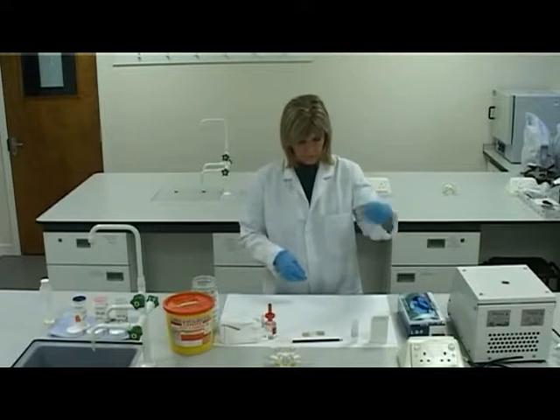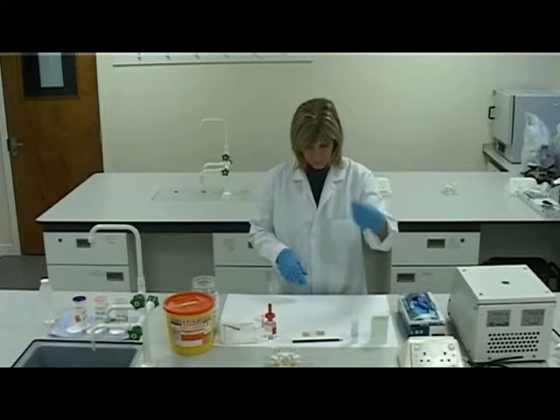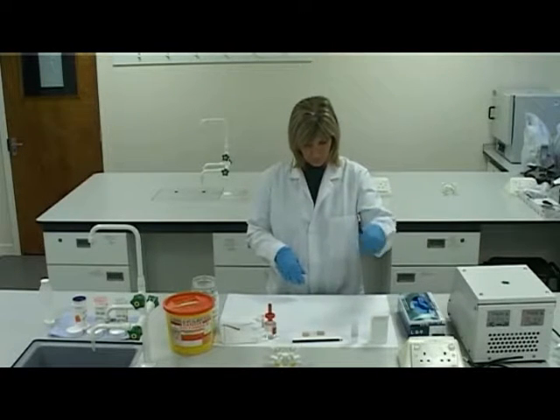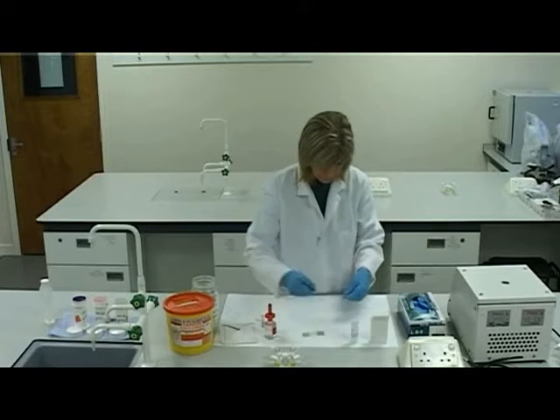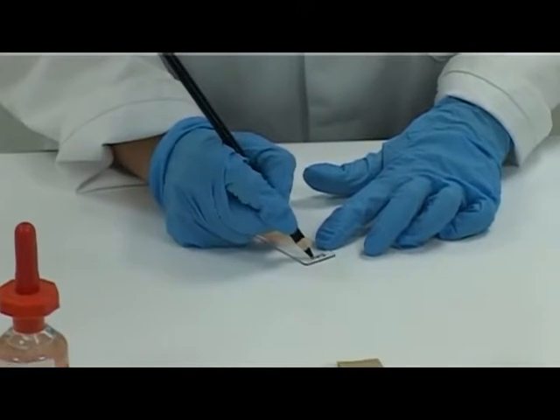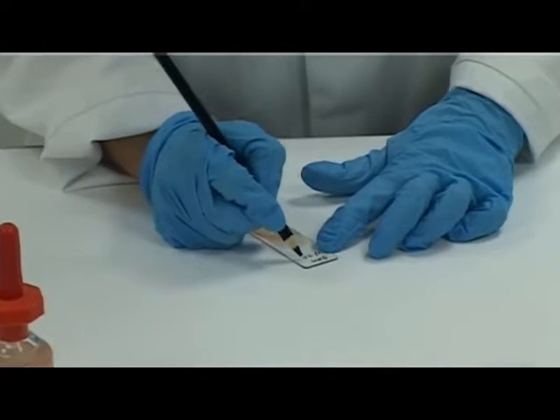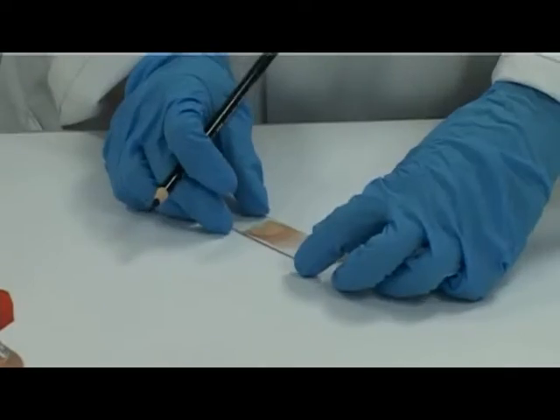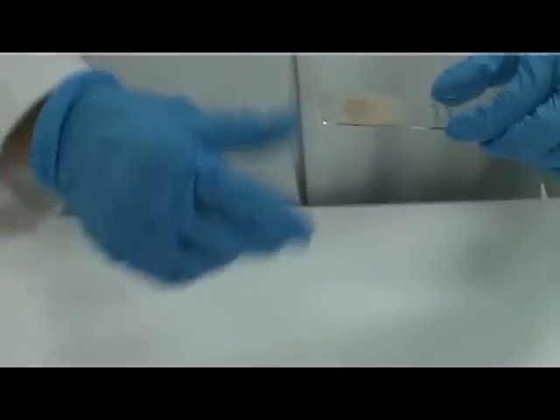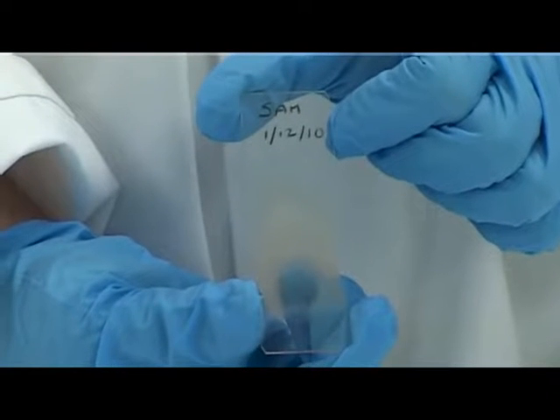Rapidly air dry the slide. Label the slide with the date and patient identification. Ensure the smear produced is of reasonable diagnostic quality, that an EDTA sample was used, and that the smear has an edge and a tail.